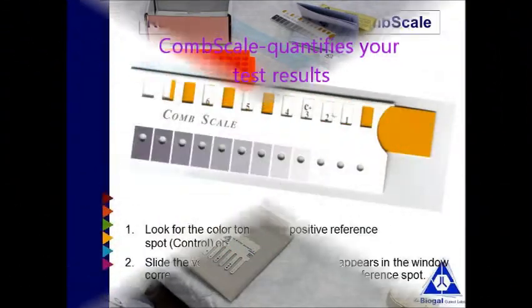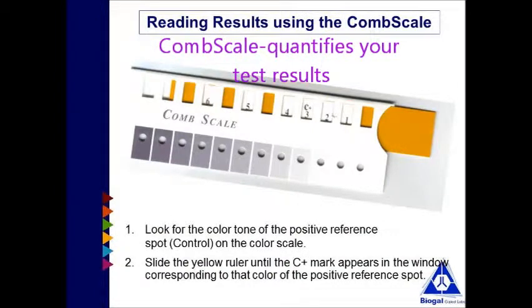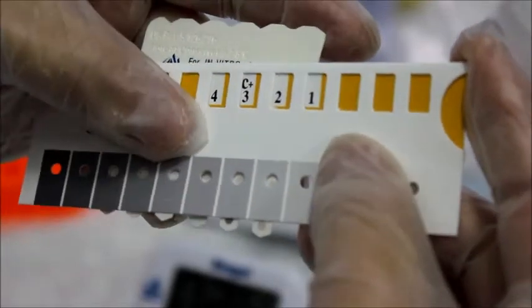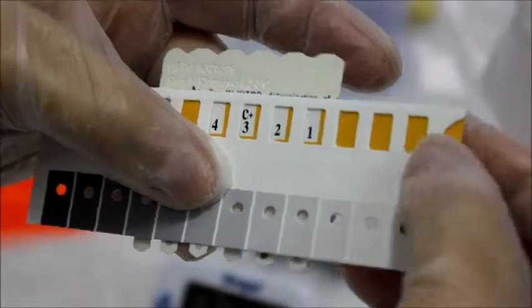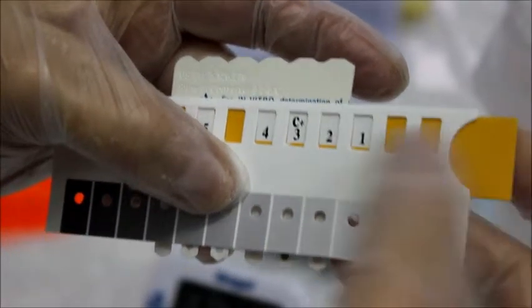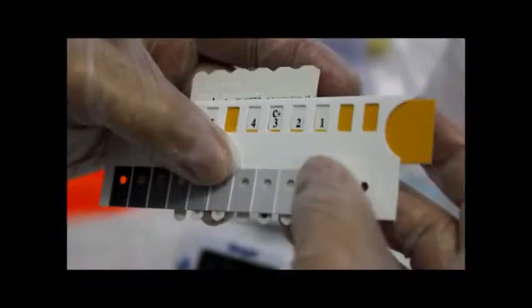Now, let's examine exactly what is the comb scale and how is it used. The comb scale is basically a simple to use measuring device used to quantify your test result. When the comb is completely dry, align it with the calibrated color comb scale provided in the kit. Find the tone of purple-grey on the comb scale that most closely matches the control spot on the upper spot of the comb, known as the positive reference spot. Slide the yellow ruler until a C+ mark appears in the window above the colour you just found. Hold the ruler slide in this position during the entire reading and don't move it anymore. This step actually calibrates the C+ to the reference number known as S3, which is the cutoff point to which test spots will be compared.